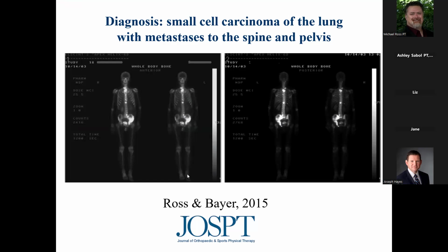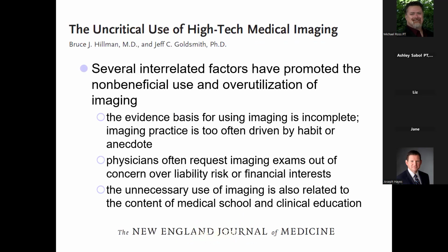With the bone scan, you inject the patient with a radiopharmaceutical, let them hang out a bit, and that radiopharmaceutical will migrate to the areas of greatest bone metabolism. Those areas light up; you may have heard they're hot spots that show up on the bone scan, and you can see that left pelvis affected. You can also see metastatic disease up into the spine, even a little bit into his right side too. The posterior view is on your right. So bone scan's helpful. It can help identify early fractures that might not get picked up even on a CT or an MRI, and it sometimes gives you a nice understanding of where other lesions might potentially be.